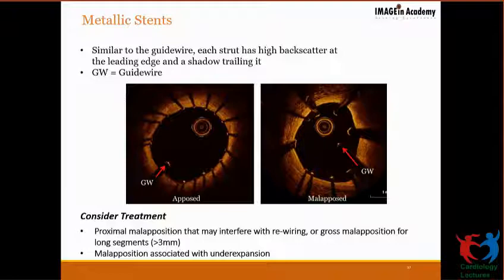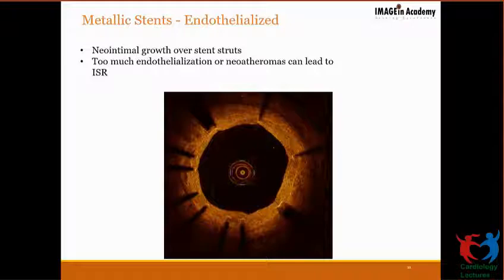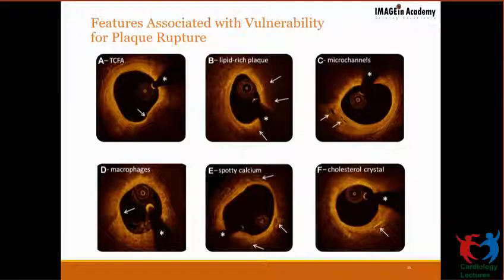You can have neointimal growth post-stent implantation. So when this neointimal growth becomes too much, it gets qualified as ISR. And you can have some different configurations of a vulnerable plaque. You can have thin cap fibroatheroma if the thickness of the cap is less than 65 micron. You can have lipid-rich plaque. You can see some microchannels as is seen in the image C. You can have macrophages. You can have spotty calcium.